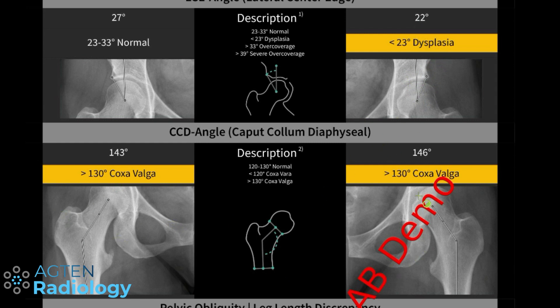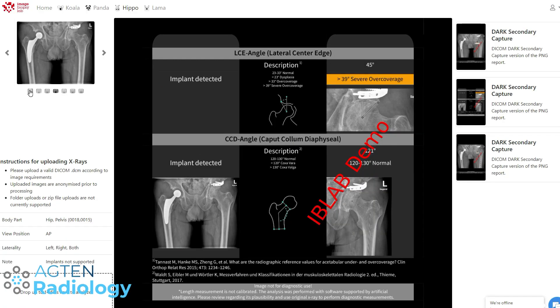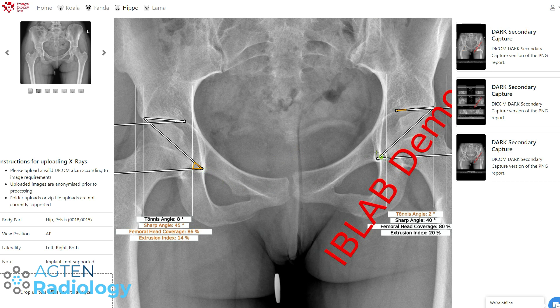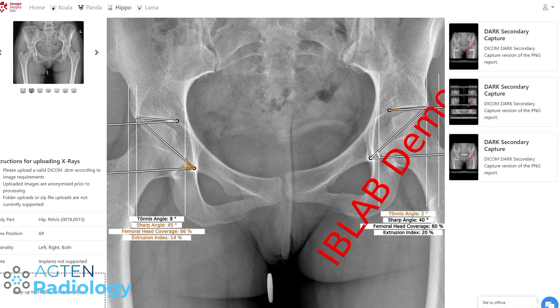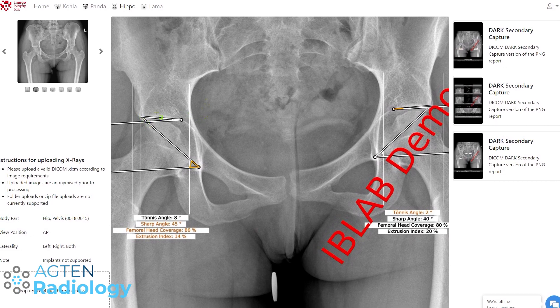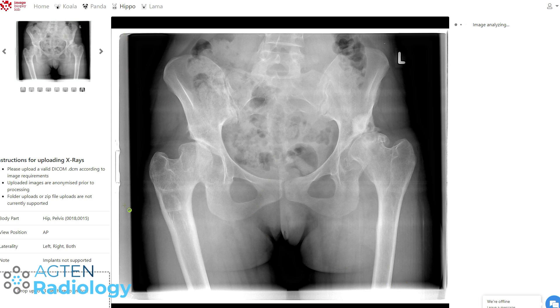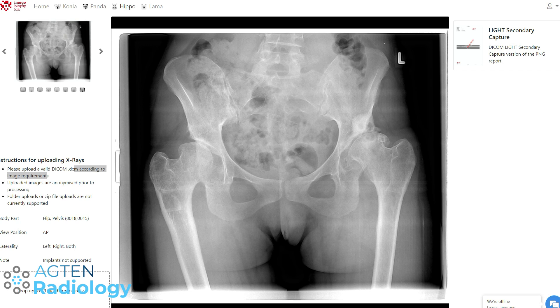The angles here are too high. Would you say the placement of the landmarks is consistent across cases? Yes, really cool — it's always targeting this teardrop figure here, which is a good landmark, and also the lateral corner. There is some variability, and even intra-reader or inter-reader variability within radiologists. For angles like this, if I measure it myself, it could be two, three, or even more degrees different from day to day. So it looks very consistent. I've got one more — a scanned image taken on purpose: a conventional radiograph on film that was then scanned. Let's see how it goes. Okay, it doesn't work.